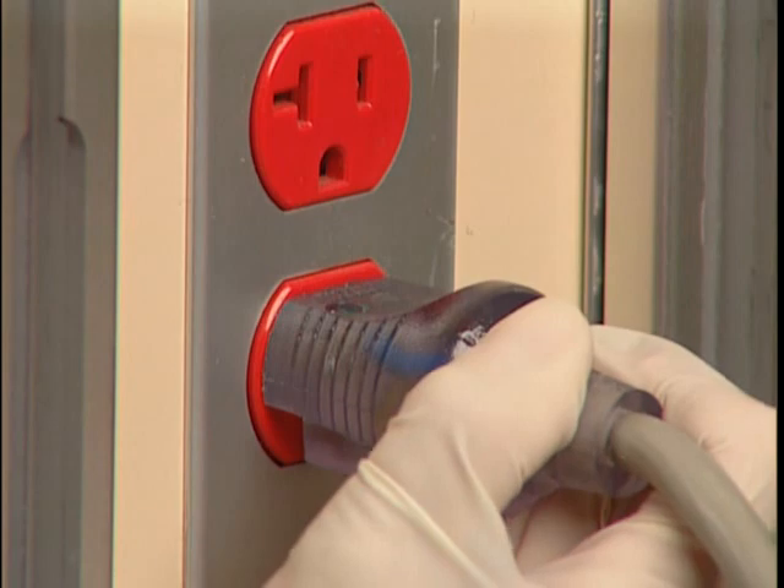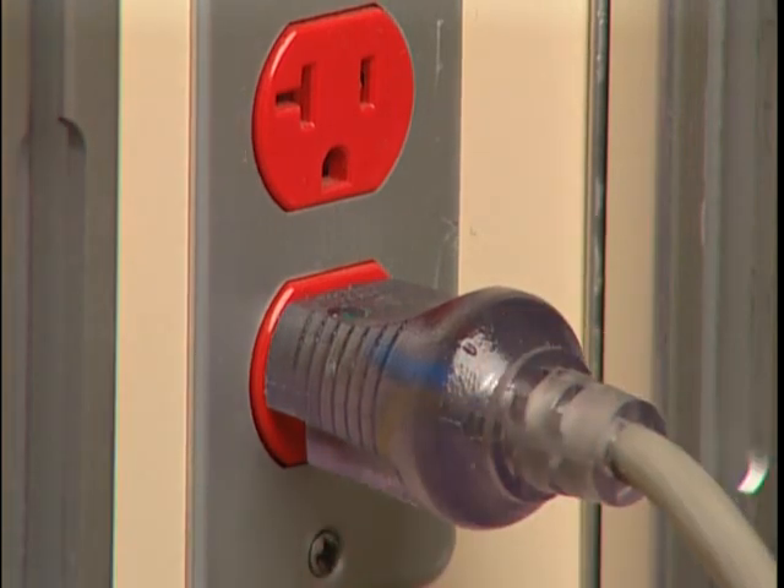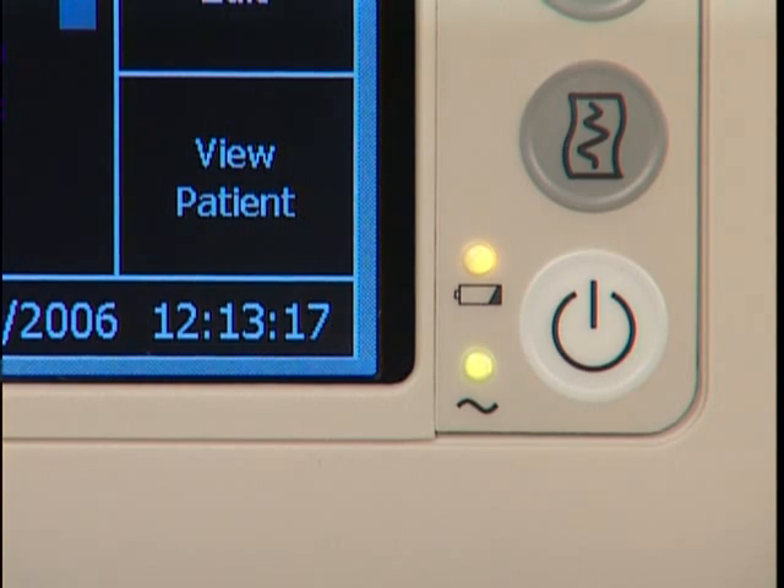The SureSigns VS3 monitor offers flexible operation using either battery or AC power. Right now the AC cord is plugged in, as indicated by this LED, and whenever it's connected to AC power the battery charges. This is the charging LED and it gives you information about the battery's charging status.